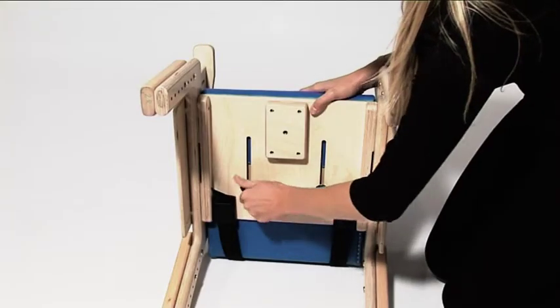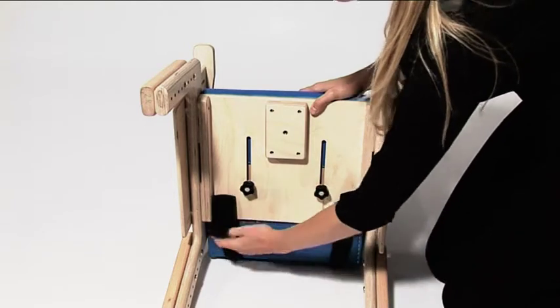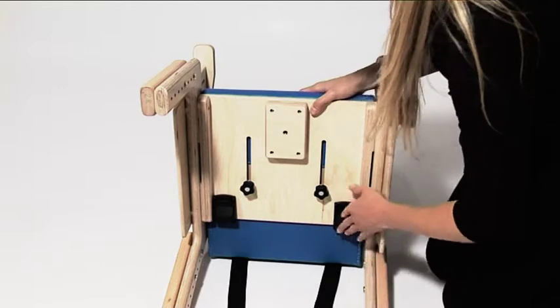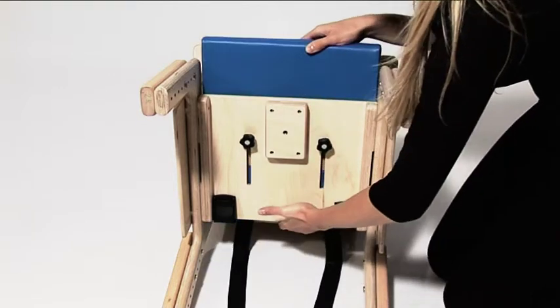To adjust the depth of the seat, loosen the hand wheels and remove the straps. Slide the seat to the desired position. Tighten the hand wheels when the seat depth is set to the desired position.